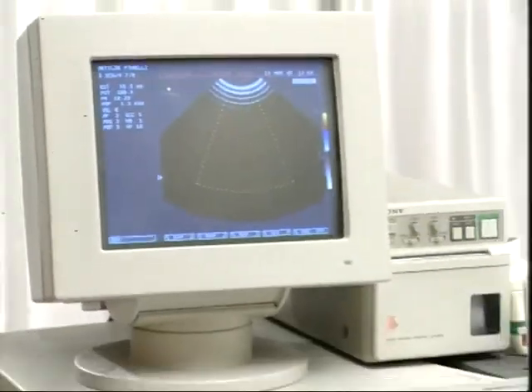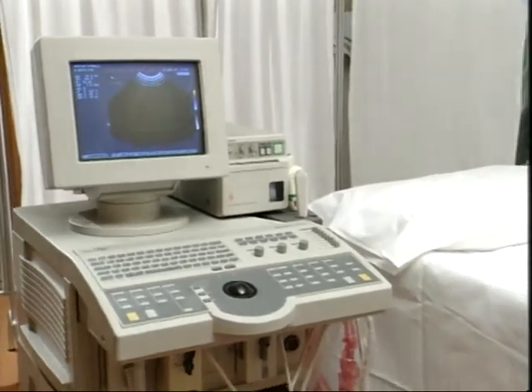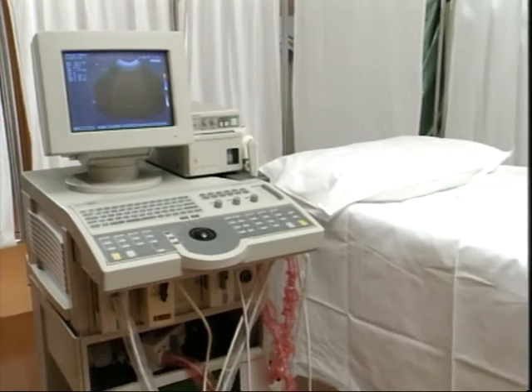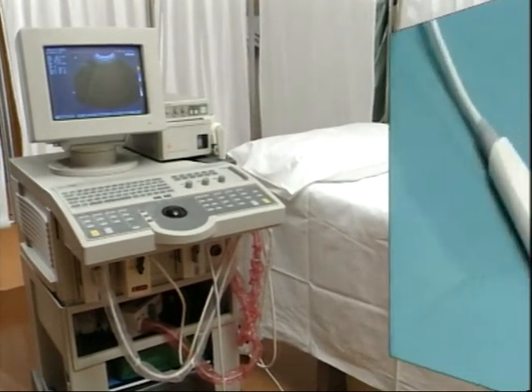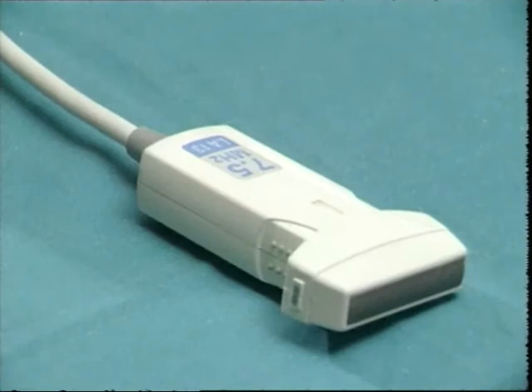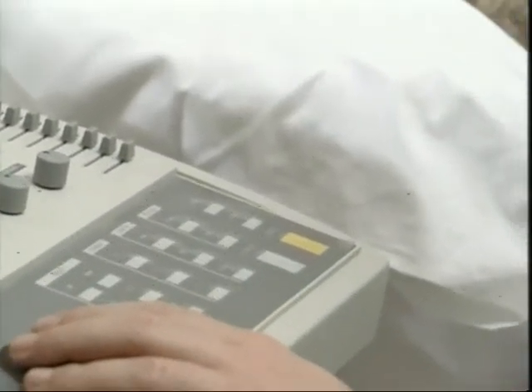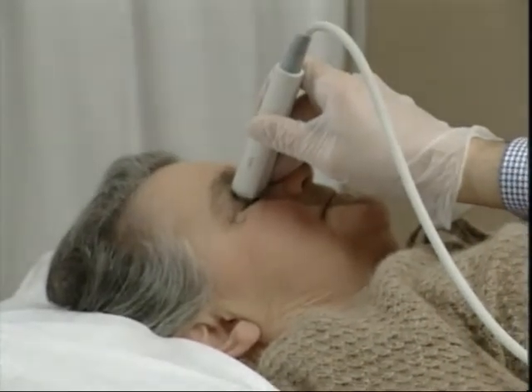In our study, we used an US apparatus Esaote AU4 IDEA with pulsed wave Doppler, color Doppler, and power Doppler. We used a 6.5 MHz microconvex probe and a 7.5 MHz linear probe. Patients were examined in supine position with the eye rotated in order to obtain the best signal.